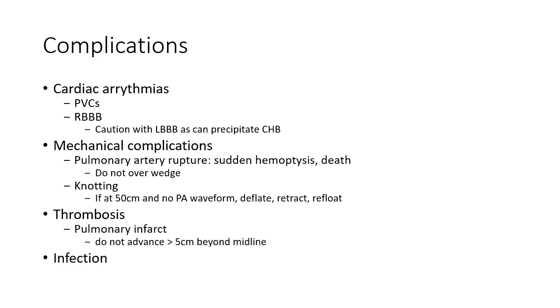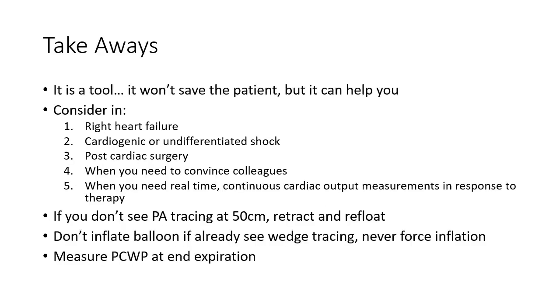Thrombosis, so pulmonary infarct can happen. So remember, don't advance beyond 5 centimeters on the midline on the chest X-ray, and then infection as with any other central line.